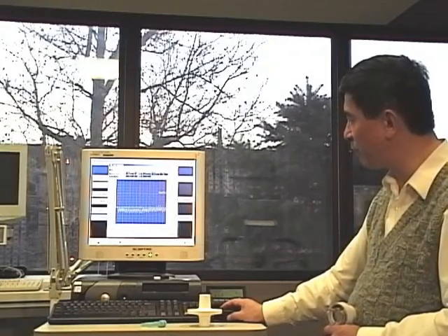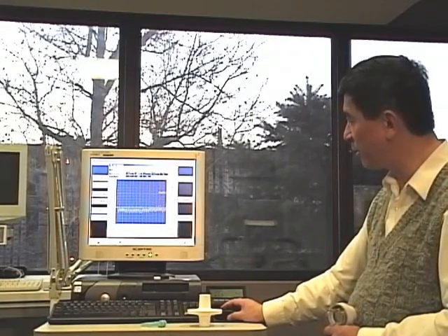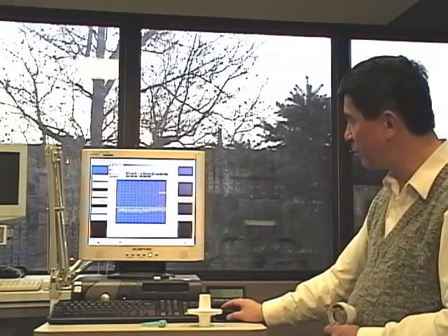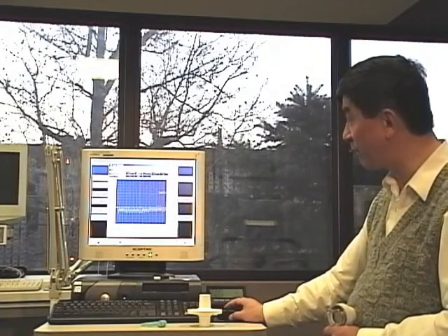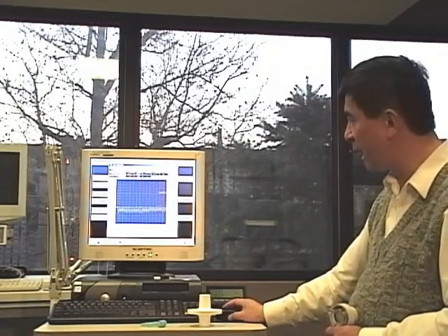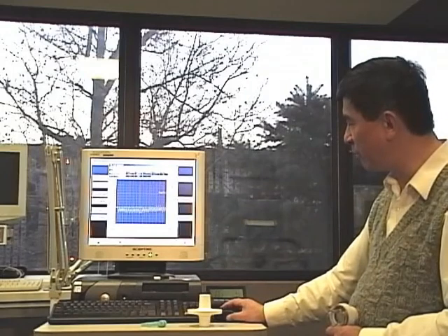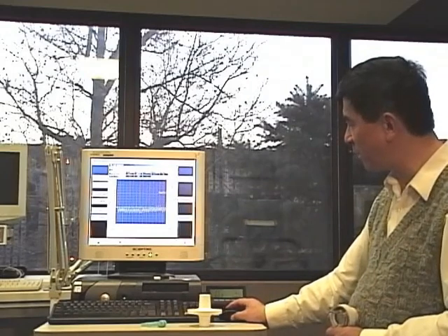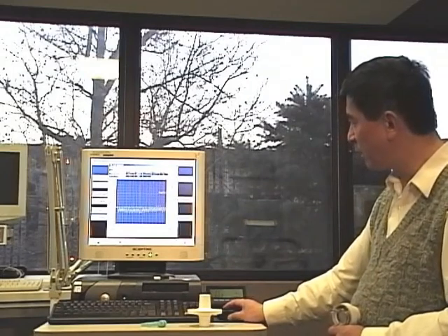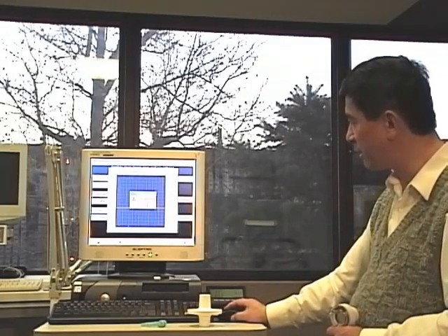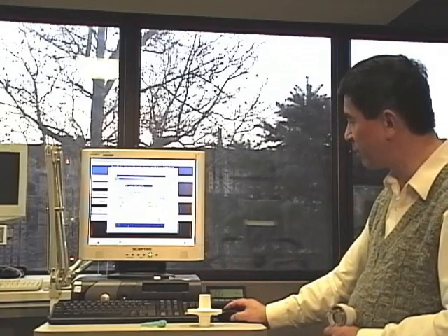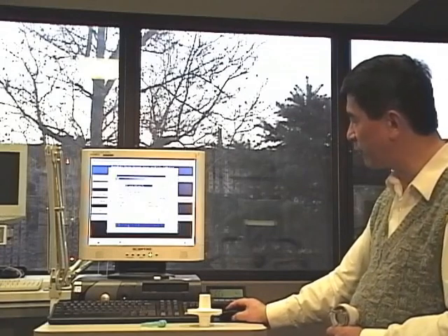Best is 152.6, second best 146, third is 128, prediction is 178 — so the highest one is 86%. That happened to be the first trial, that's the best. And then we say save test, click OK — we can save successfully and print. Thank you.